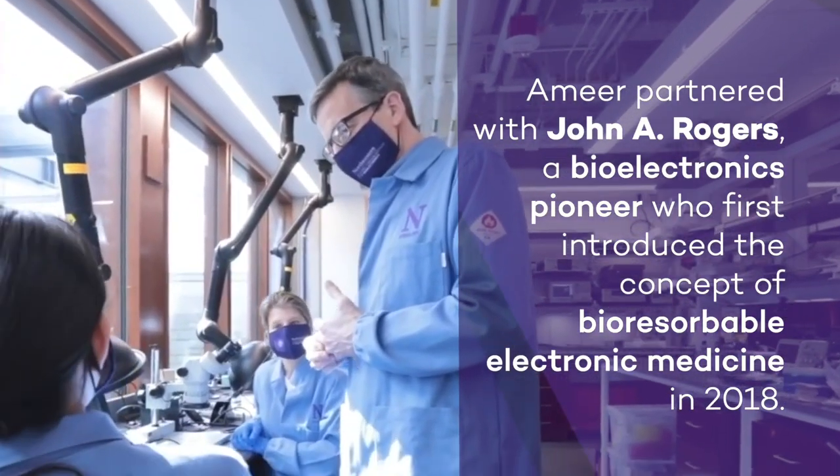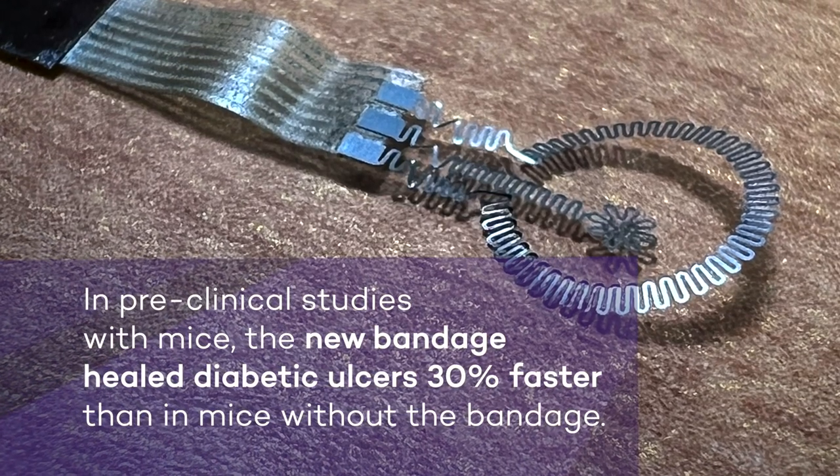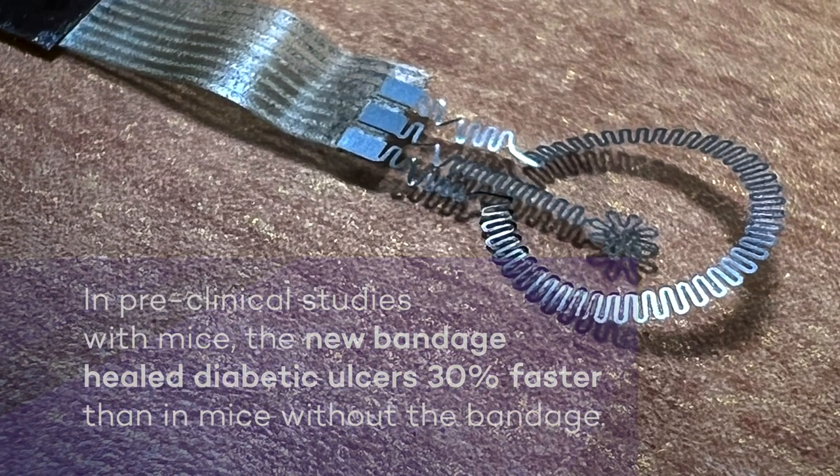We identified that stimulating the subject for 30 minutes a day — only 30 minutes a day — was enough to see a very big difference. What we are really doing here is allowing cells of the right type, skin cells, to migrate into the wound a lot faster than they would typically.